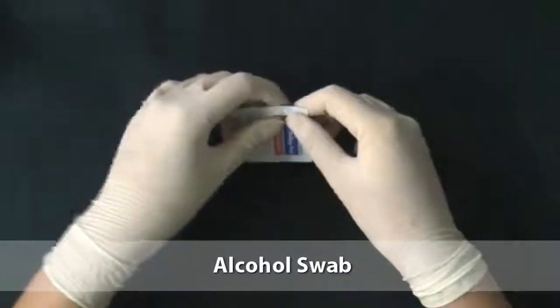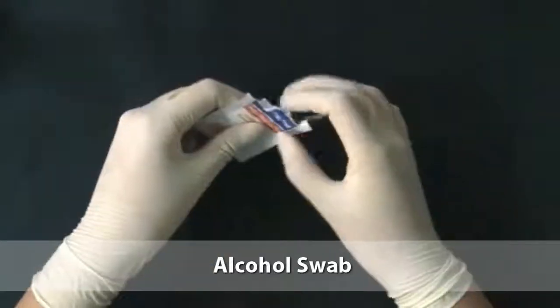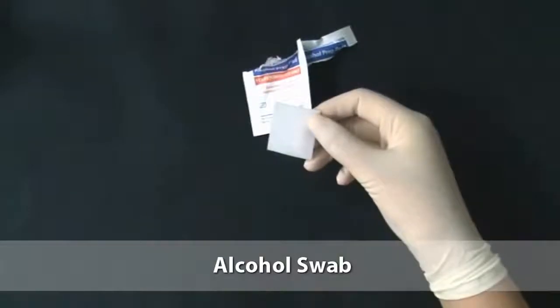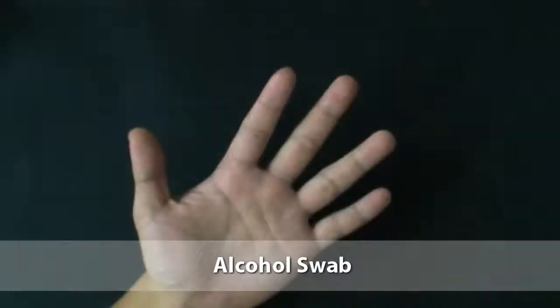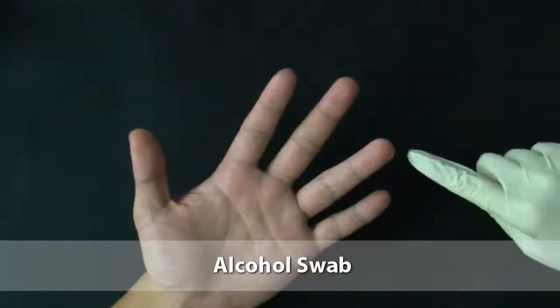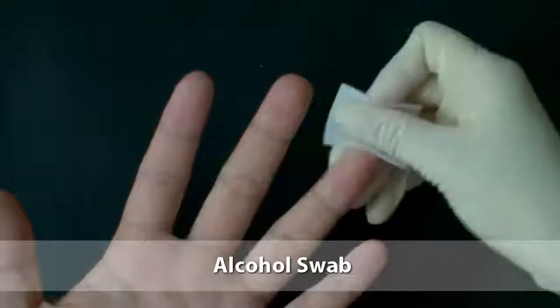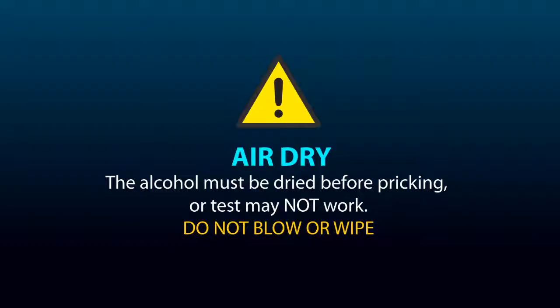Open the alcohol swab. Grasp the fourth finger of the patient's hand and clean the patient's finger with the alcohol swab thoroughly. After cleaning the finger, it must be allowed to air dry. Remember, the alcohol must be dry before pricking, or the test may not work. Do not blow or wipe the finger when you dry.